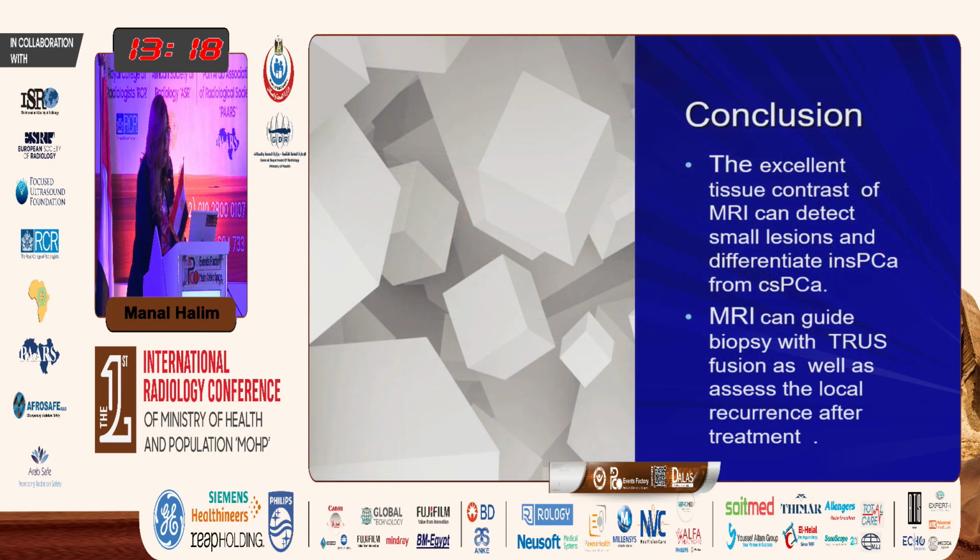Conclusion: the excellent tissue contrast of MRI can detect small lesions and differentiate clinically insignificant cancer from clinically significant cancer, and MRI can guide biopsy with transrectal ultrasound fusion as well as assess local recurrence after treatment.